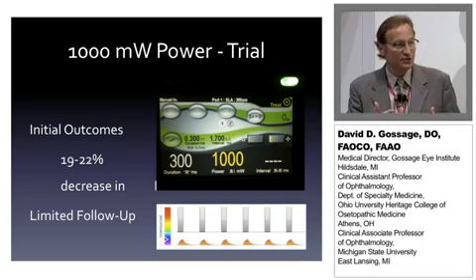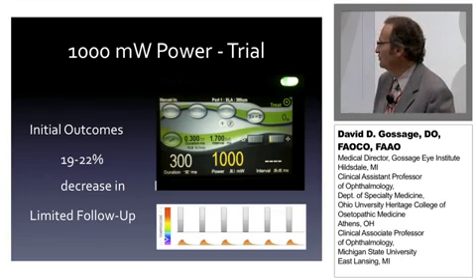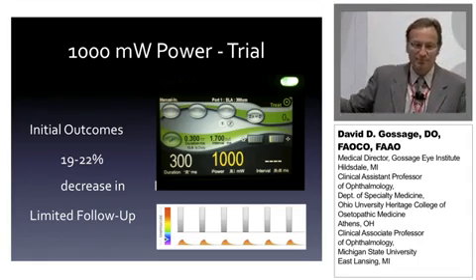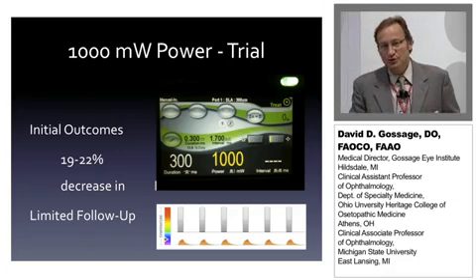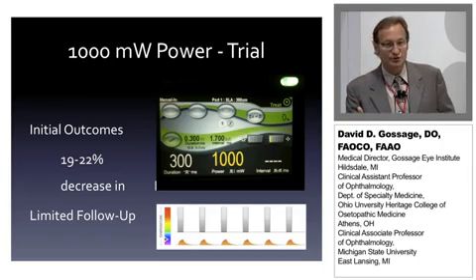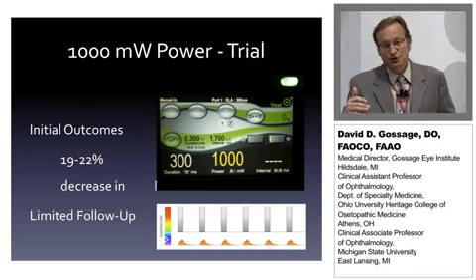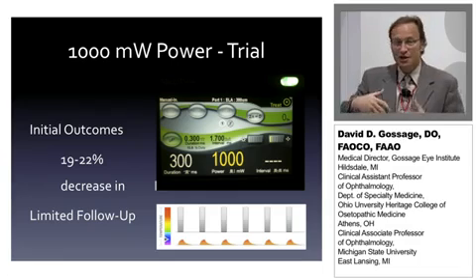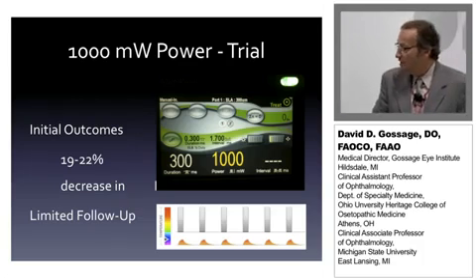I haven't seen all those patients back yet, so I'm not sure what we're going to be at in 3 months or 6 months. What I can tell you though is I had one patient, if you went back on the slides, a patient who had a pressure of 25 initially, was treated with 700 milliwatts of power. She went from 25 down to 22, and then I treated her with the 1,000 milliwatts, and she went from the 22 down to 17. So from that standpoint, we see it's repeatable and also maybe get a little bit more effect with the higher power.